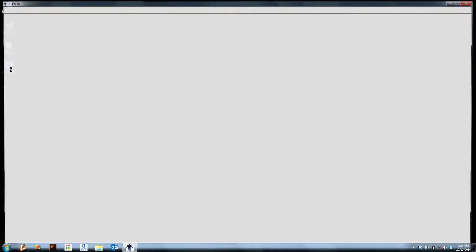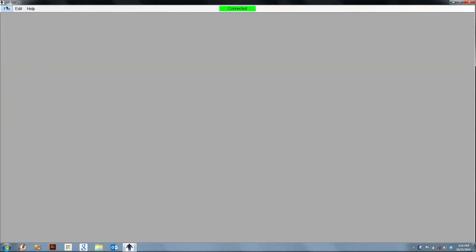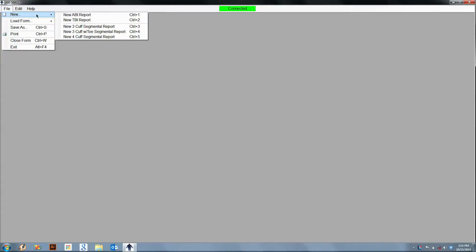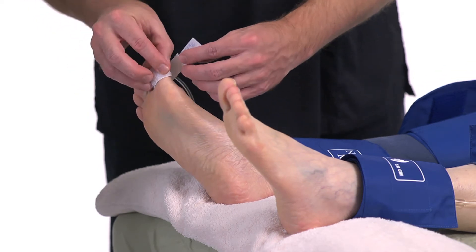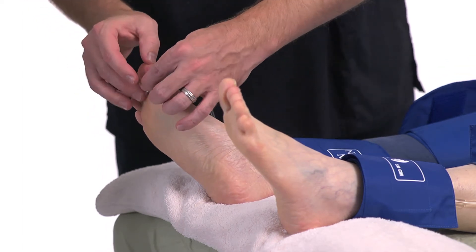Begin by selecting the TBI exam from the File menu. Wrap the arm cuff as was done in the ABI section. Place a small digit cuff on the great toe and the PPG sensor distal to the cuff.